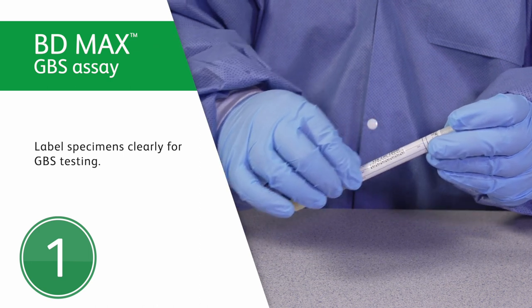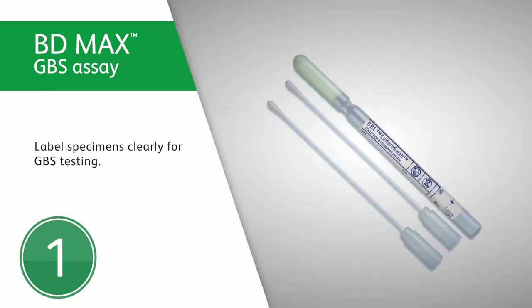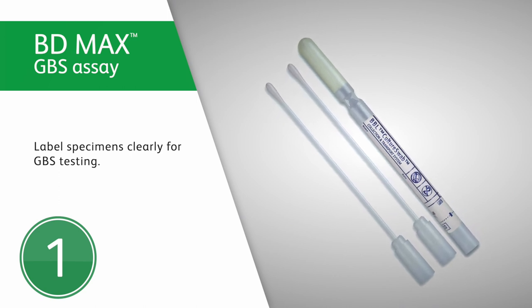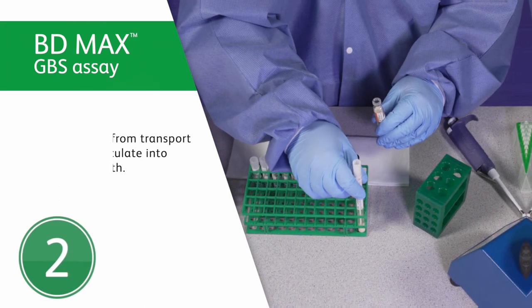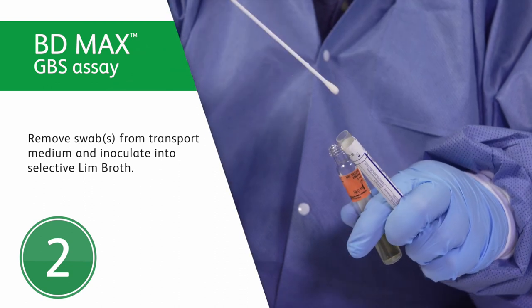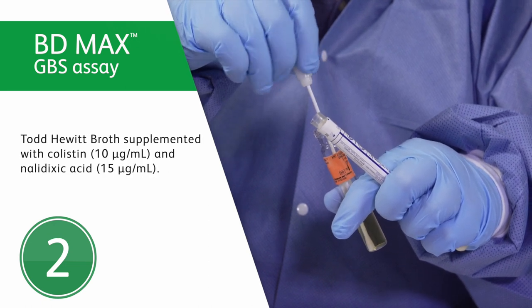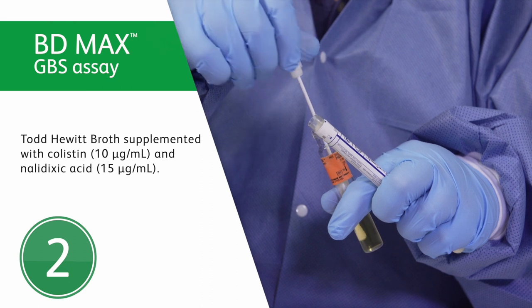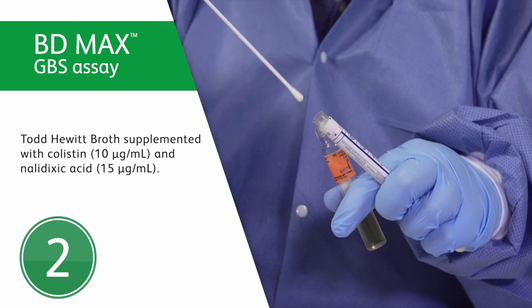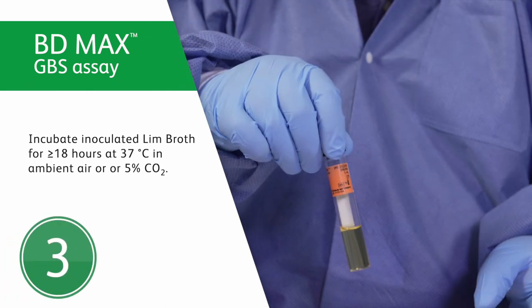Label specimens clearly for GBS testing. If both vaginal and rectal swabs are collected separately from the same patient, both swabs can be placed in the same transport container. Remove the swab or swabs from the transport medium and inoculate them into selective LIM broth. You can create LIM broth by using Todd Hewitt broth supplemented with 10 micrograms per milliliter of colistin and 15 micrograms per milliliter of nalidixic acid.